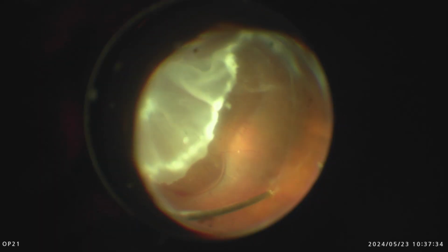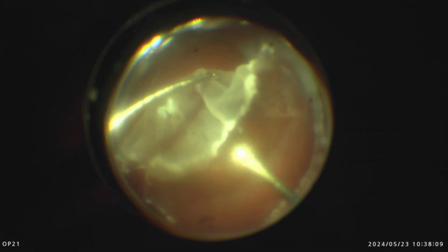Diathermize any bleeding, being as careful as possible not to cut any of the choroid. And that which you saw there at the 10 o'clock location is most likely the causative break.